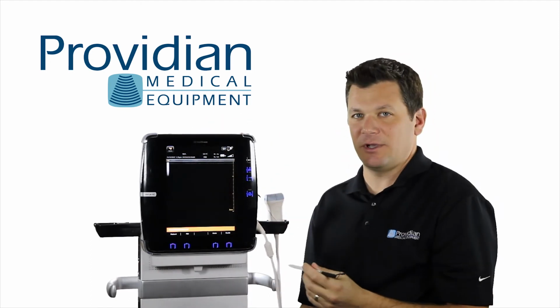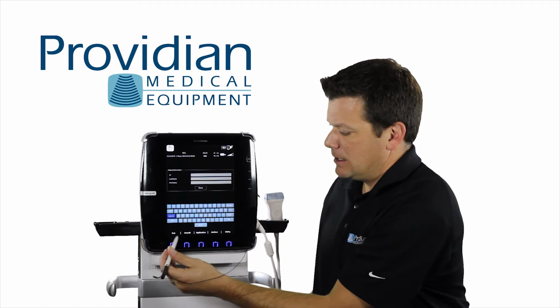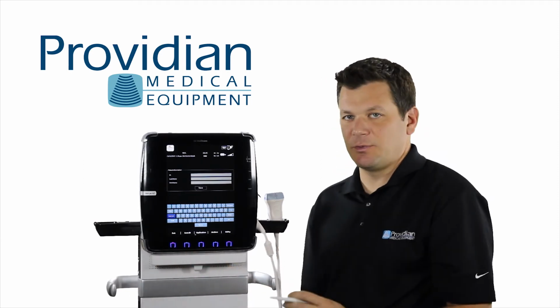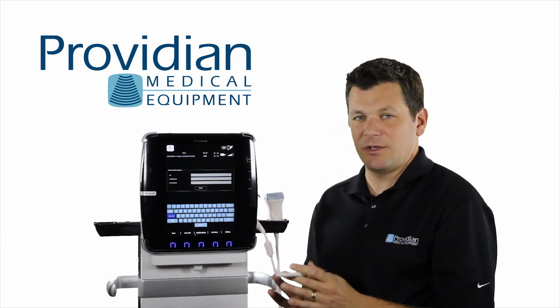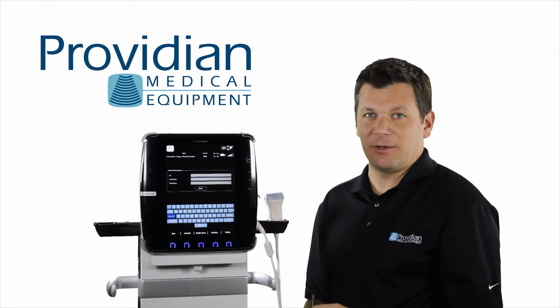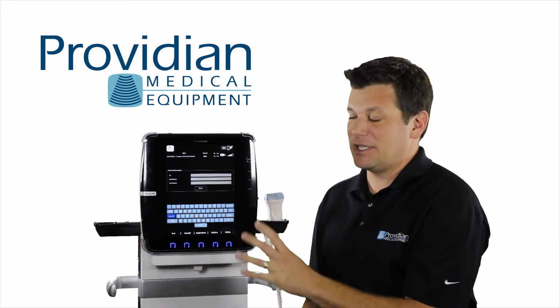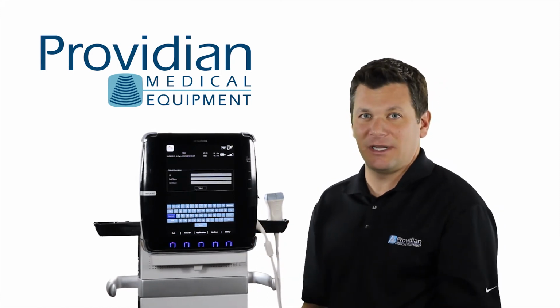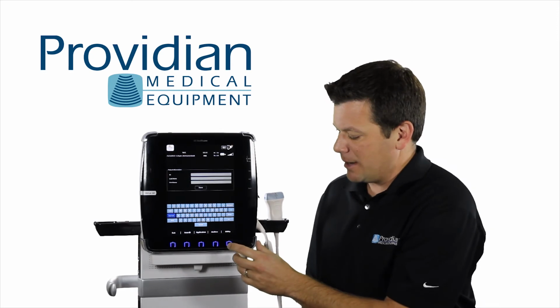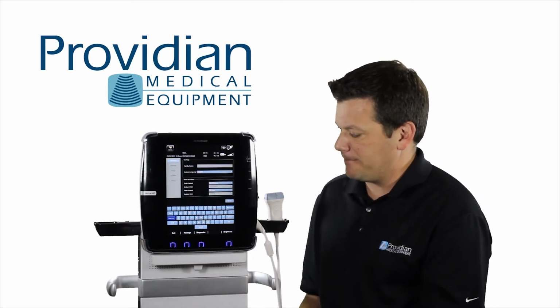So now it goes to the imaging screen, but again, let's say I didn't want to go with these MSK settings. Say I was doing a vascular access. Go up top and select patient. It's going to give me this application, and this is where it's a little confusing. Application will tell you exactly what you can get within this MSK. When it booted up, it said it was at the musculoskeletal. There's two different application settings. If I just stick with that MSK it booted to, I'm not going to get as many of those color Doppler features. I'm going to go here to utility and say I'm going to use the same one each time.